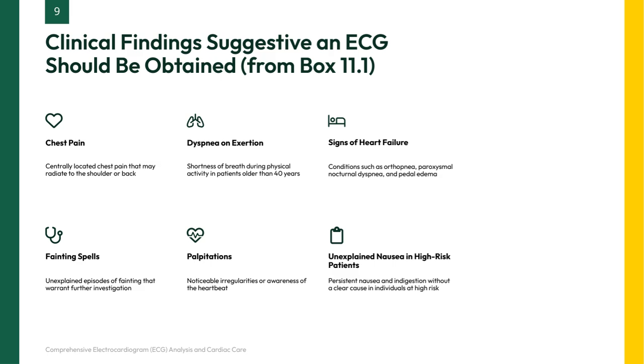Signs of heart failure also warrant an ECG. Symptoms like orthopnea, difficulty breathing when lying flat, paroxysmal nocturnal dyspnea, which is sudden nighttime shortness of breath, and pedal edema or swelling of the feet are classic indicators. Unexplained fainting spells are another concern, as they could reflect arrhythmias or other electrical issues in the heart that an ECG can reveal.